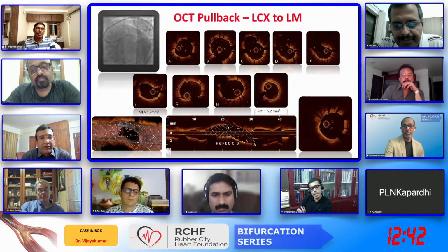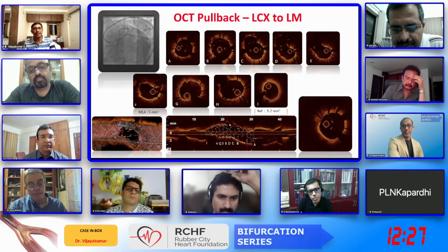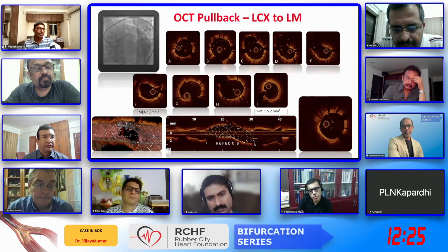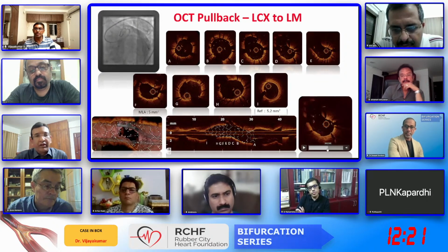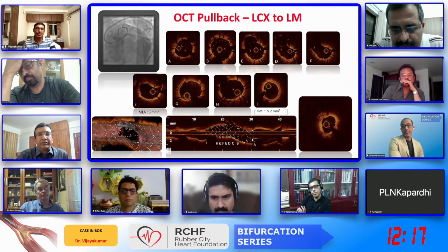Yeah, this is a cell. So you can just see a connector here. This is a two connectors cell stent, so it is highly unlikely you have a connector here. So it is most probably a link-free carina type. And the wire, you can see that it has gone through that cell. You can see in the long view, the system has not recognized it properly. And even 2D wise, it is coming just closer to the carina. So it is most probably a distal cross.